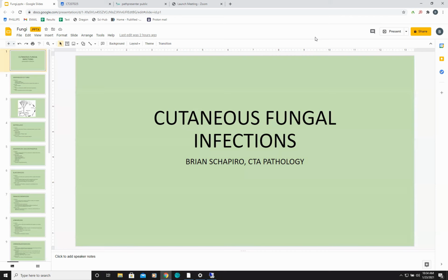Today's talk is on cutaneous fungal infections. This is an enormous subject, a kind of bear of a subject. So what I've done is put together a little PowerPoint on the basic fungal infections, and then given these are so rare, I have pulled some slides from Path Presenter, and I'll show those, and then I'll also show some slides from our own records.